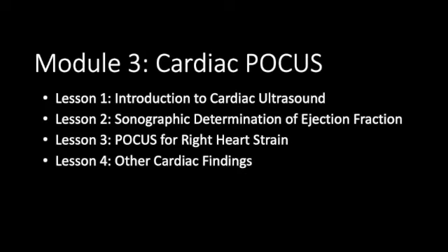Welcome back to the Waco Family Medicine Point of Care Ultrasound curriculum. This module will focus on using point of care ultrasound to evaluate the heart.